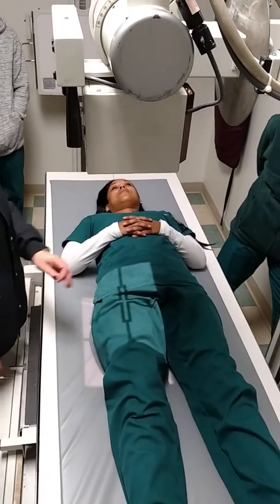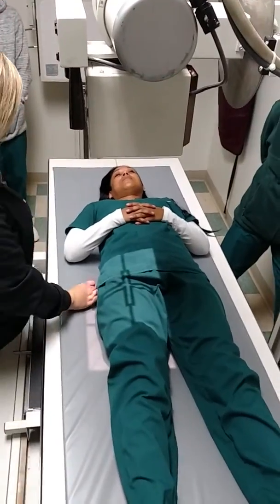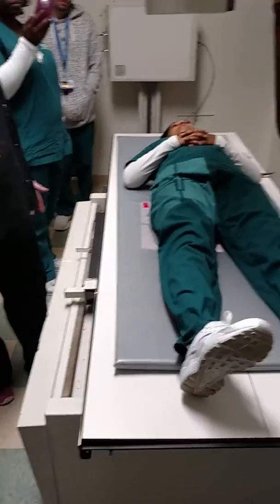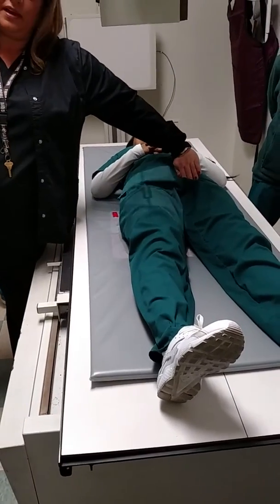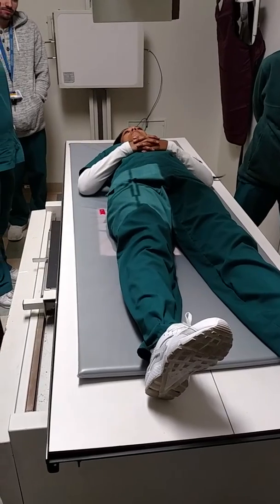Now to make this a true AP, we need a 15 to 20 degree medial rotation. Stick a right marker right there. Can I shield? No. I could do 1 gonad, not necessary. All right, hold your breath, beep.